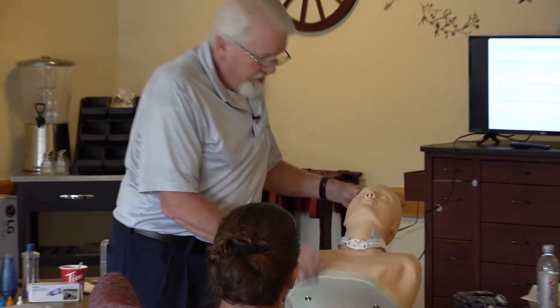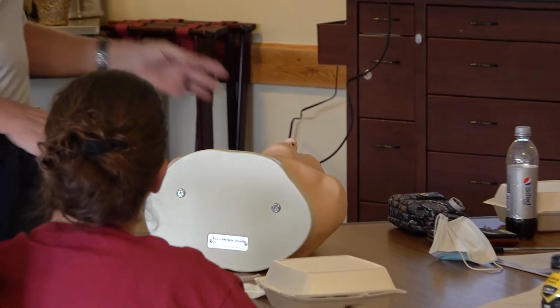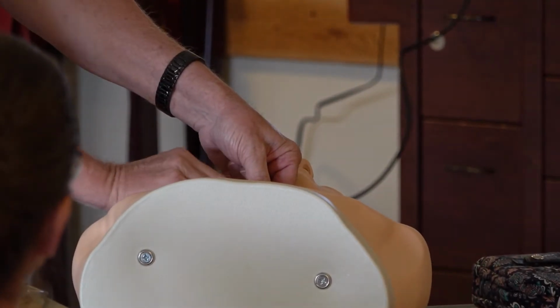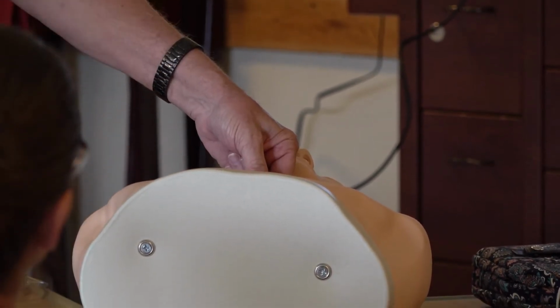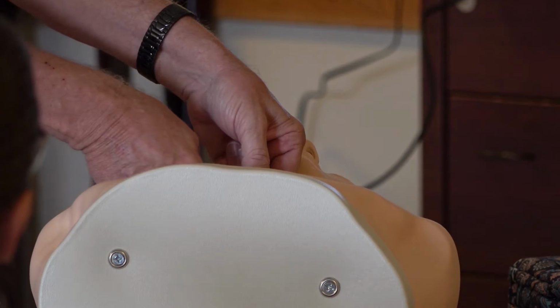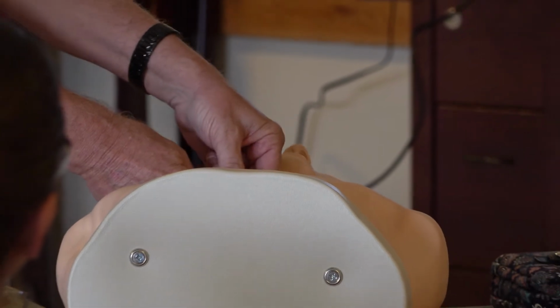So anyway, I'm going to take the new collar, just like this. I'm going to open it up and I'm going to slide it underneath Bob. Okay? So I've got it ready to go up. So what's going to happen is when I secure the flange, I undo this side of Bob's collar. Good Velcro. And I lay that edge down. I'm still here on this side. I'm going to grab the new collar, run it up here, feed it through or attempt to feed it through here. And we're going to hook it.